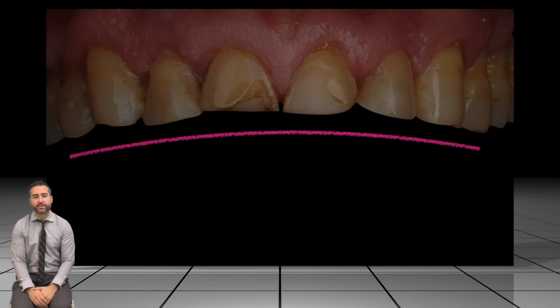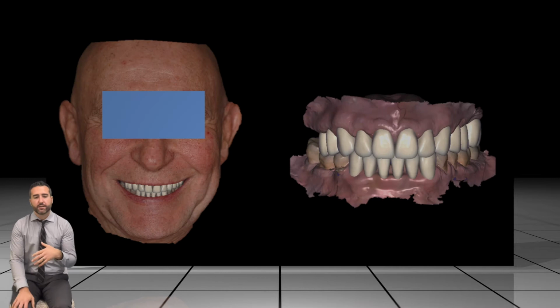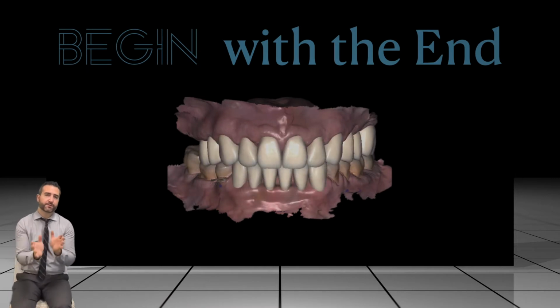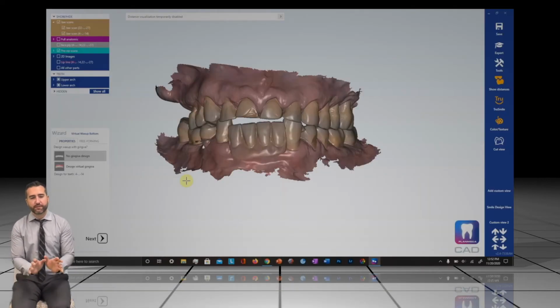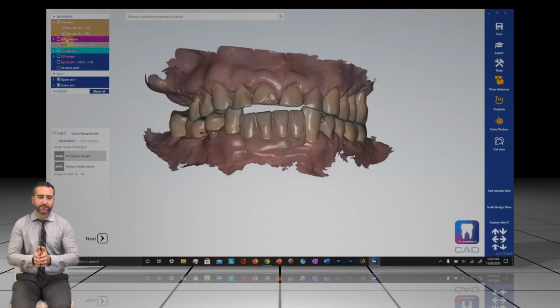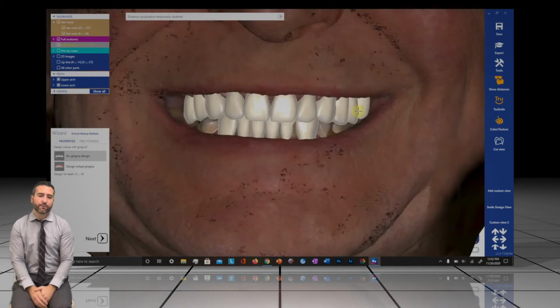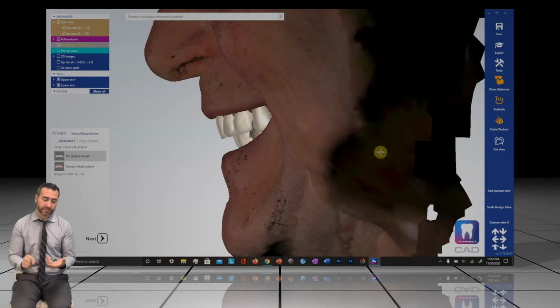This is a case that we did most recently, and this patient had some occlusal issues. They lacked anterior guidance, they had anterior open bite, they had reverse smile lines. So quickly in PlanCAD Premium, we waxed this case up digitally, and we were able to show the patient what they would end up with if they went through treatment. And of course, this software is extremely powerful now because we're jumping out of the single unit chairside software and into software designed for full service laboratories. So it could do smiles, dentures, partials. It could do basically full mouth reconstructions and anything like that.